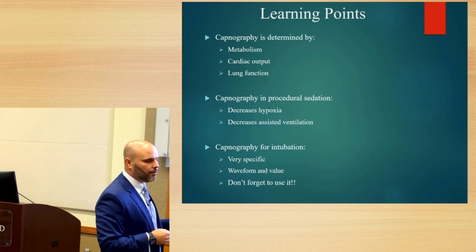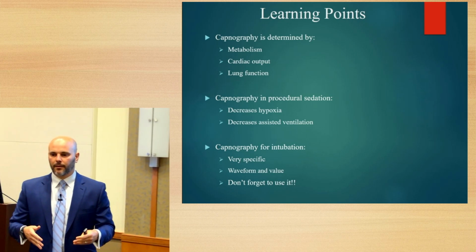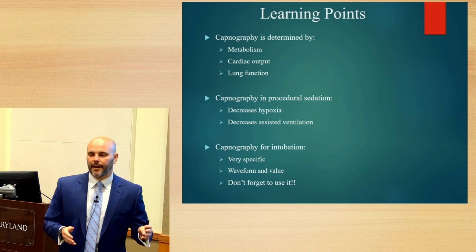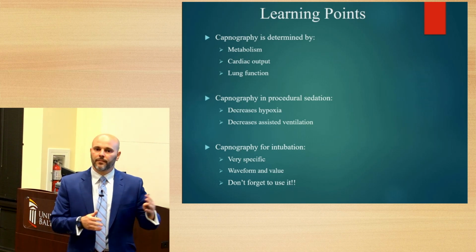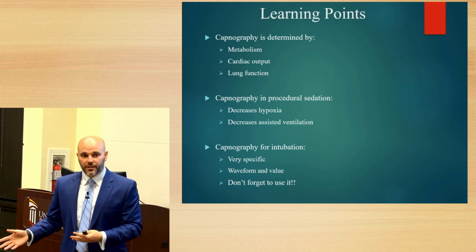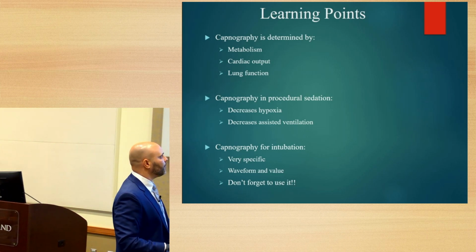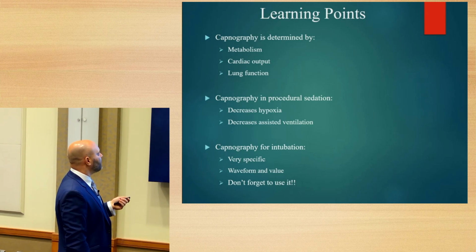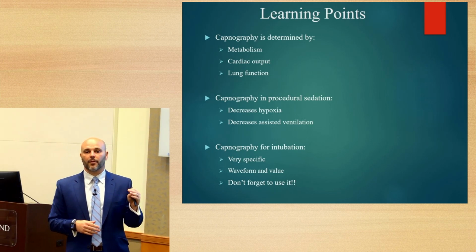So I've taken you through the pre-hospital setting, I've taken you through the early resuscitation setting, and how even the ICU and the intubated patient can utilize end tidal to identify sick patients and to improve patient care. And we're taking it home by rehashing the learning points. So capnography is determined by the pillars of metabolism, cardiac output, and ventilation, or the lungs.